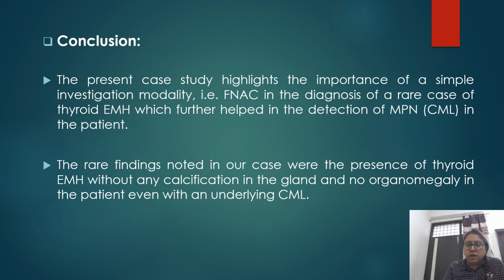So to conclude, this case report highlights the importance of a simple investigation. सोचो आप, एक FNAC से you can diagnose a rare case in thyroid EMH, which further helped in detection of MPN in patient. So the rare findings noted in our case were thyroid EMH without calcification, and also see CML, जब आप पढ़ोगे ना, organomegaly is a very important feature. So splenomegaly, hepatosplenomegaly is very common in CML. Here in this patient after systemic examination, no abnormality was detected. ठीक है. बहुत सारे rare points थे इस केस में.